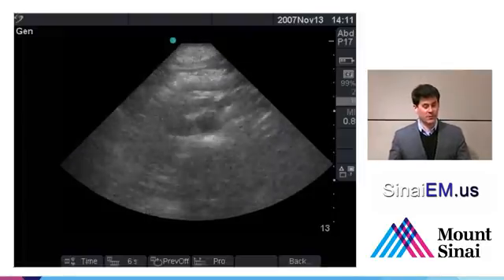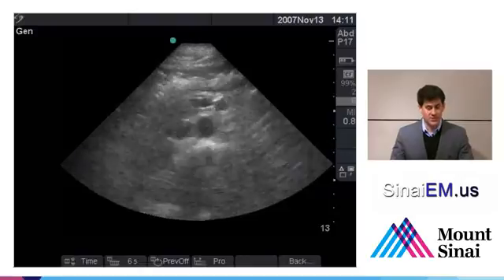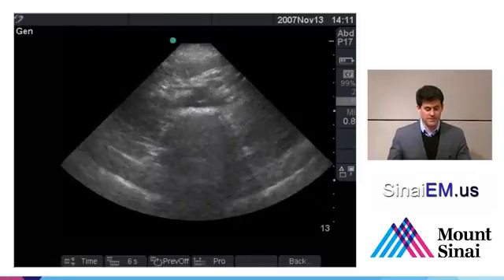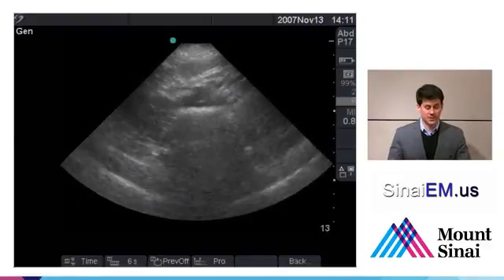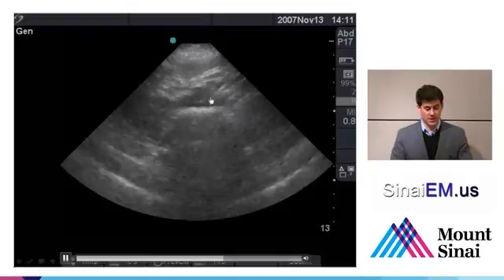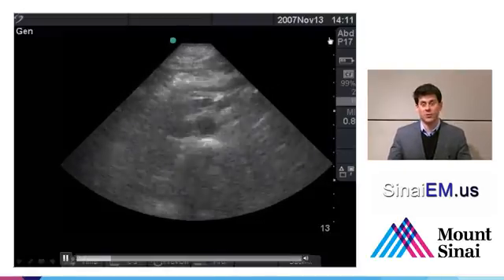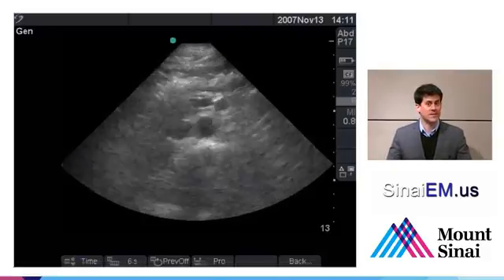So here's a real-time scan through a real patient. This is done actually with a phased array probe, so you can see that you can get decent images with that probe as long as it's in the abdominal mode setting. So we start here in the proximal aorta, and we're scanning distal, and then you notice that the iliac vessels are bifurcating. As we loop continuously again through seeing the aorta, we lose it with some bowel gas, and then we see the bifurcation happening. So starting again, aorta, lose it with some bowel gas, bifurcation. I'm not suggesting that we can find every patient's aorta in 4 to 5 seconds, which is how long this clip takes to visualize this patient's entire aorta, but it doesn't have to take very much time.